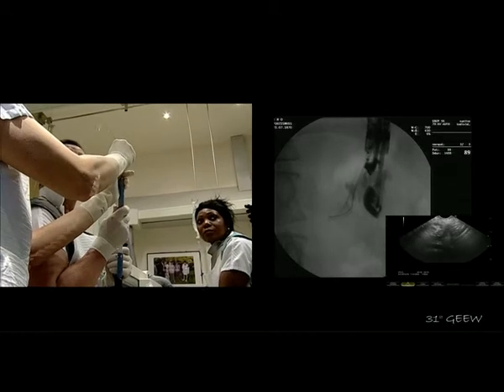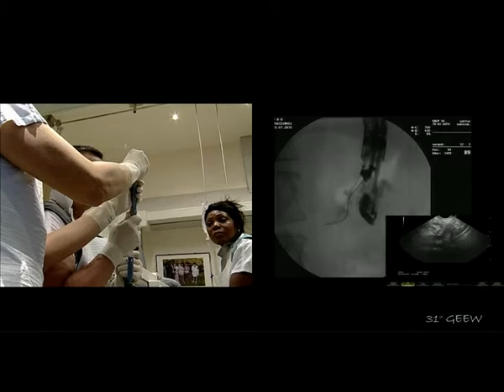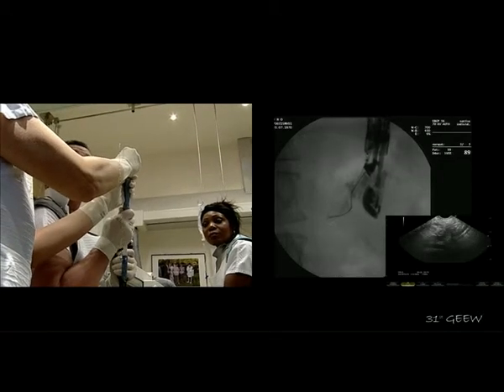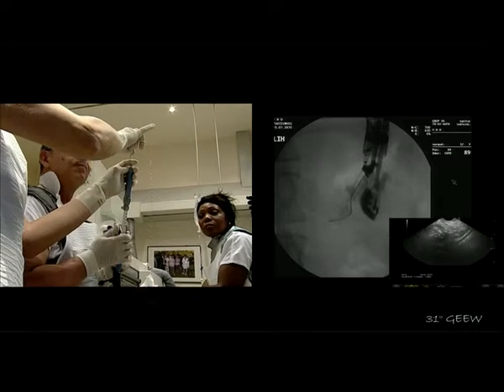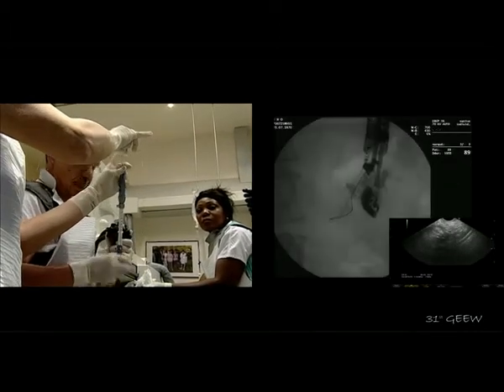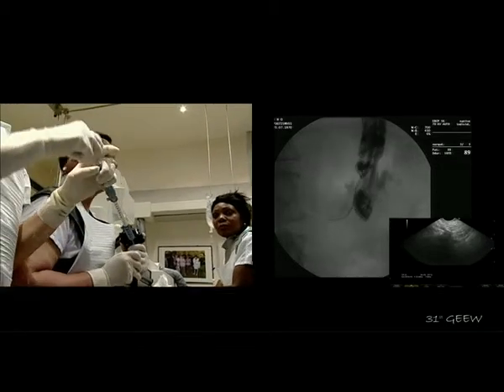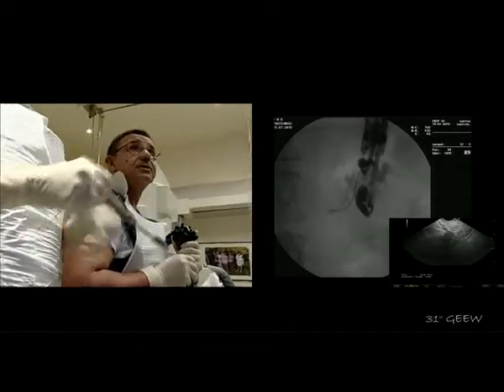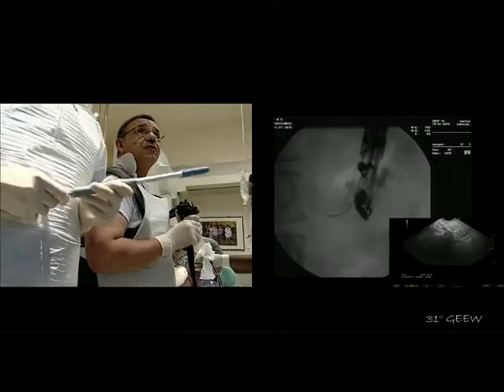So you see that this is typically the case where we have no chance to place a large stent, because the stent that we will place has to make the curve to create and to maintain the fistula. So the stent that we will place will be a 5 French stent to start, and then we will come back again with a longer one. A 5 French 9 centimeter will be first the cystostome, hein, Jacques.